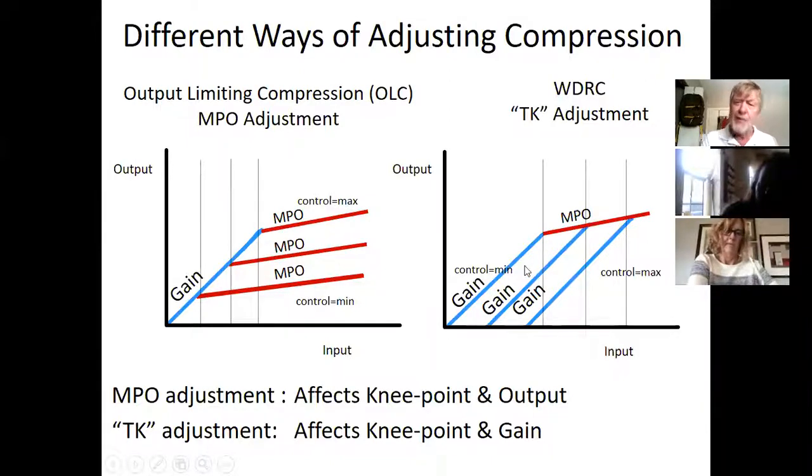Well, if you had maximum gain for soft inputs, maybe internal hearing aid noise might become audible. Maybe the guy's got excellent low frequency hearing. Maybe the hearing drops off like crazy. So the guy's hearing at 125 and 250 is really good. And then past 1,000, it goes down. Well, then if you have the maximum gain for soft inputs, you might get this problem. My hearing aid is hissing in quiet. It's giving maximum gain for soft inputs.